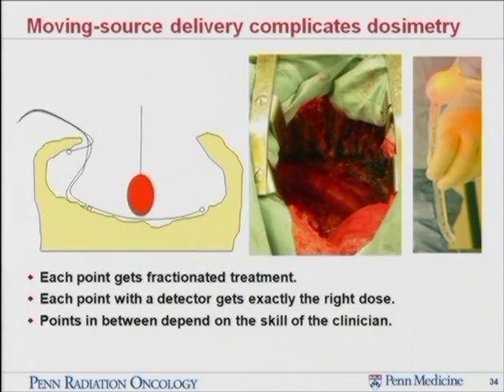to bleeding, for example. And typically, the surgeon is doing a very good job to stop all the bleeding, and you pour in intralipid into it to dilute the blood too. But sometimes you can see bleeding in the cavity, so you have to pump out the blood and put in clear diluted intralipid to make sure it's not absorbing all the light before it reaches the surface.